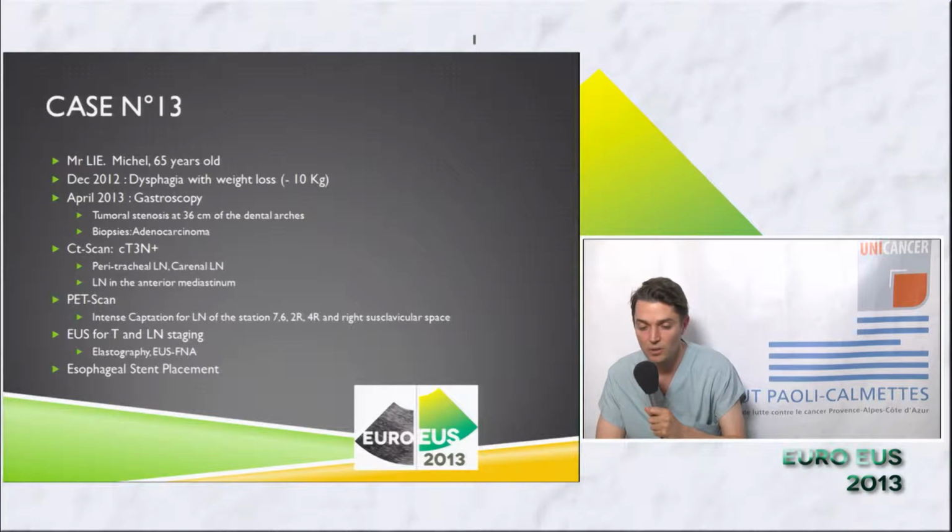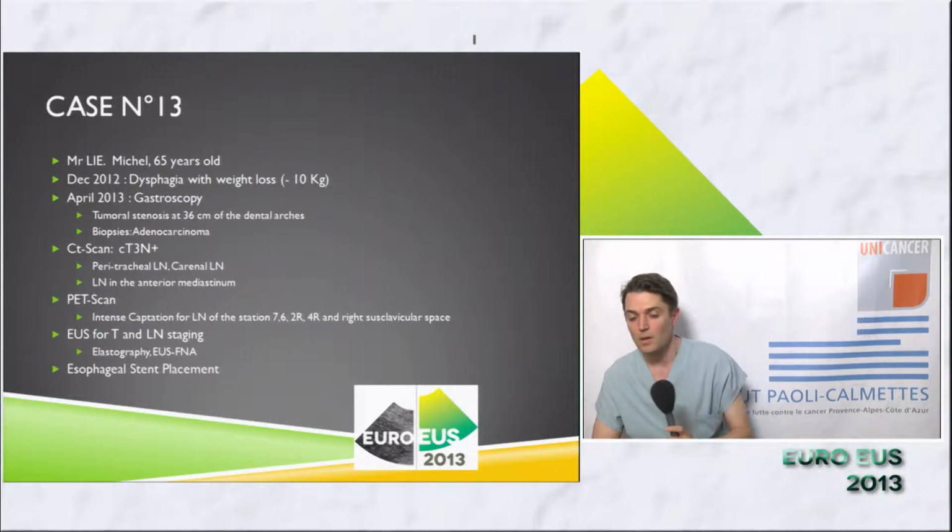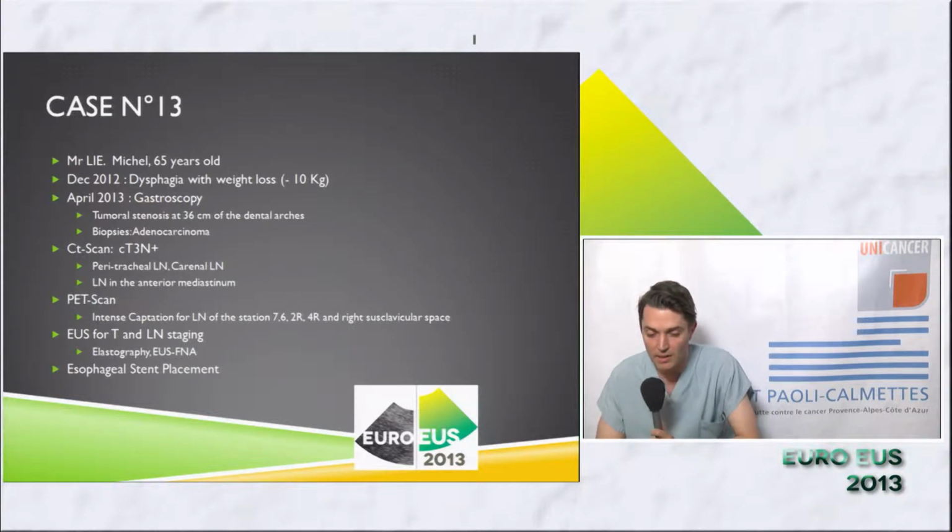The CT scan showed a lesion classified T3N plus with a lot of lymph nodes, peritracheal, carinal, and in the anterior mediastinum. The PET scan confirmed intense captation for lymph nodes in different stations.